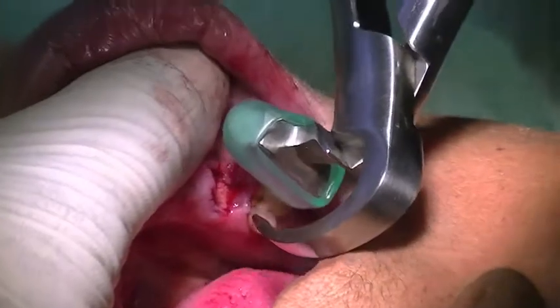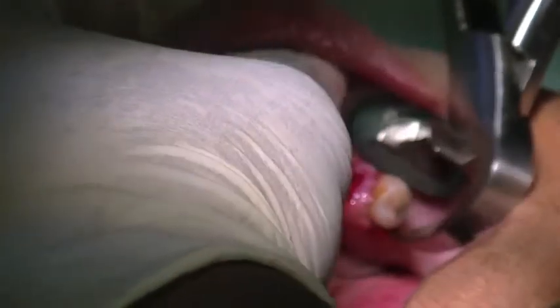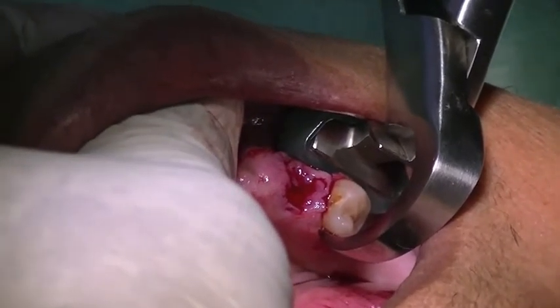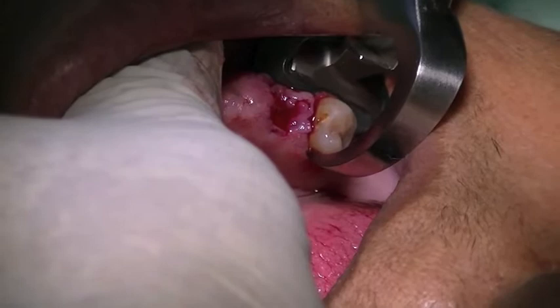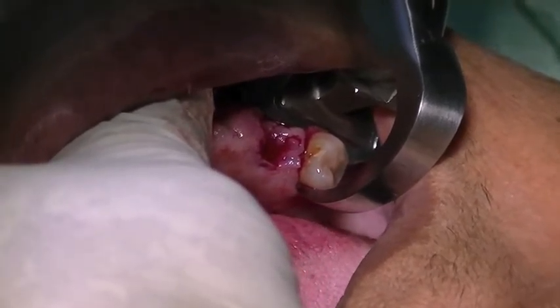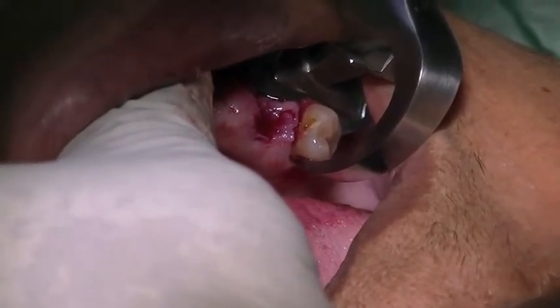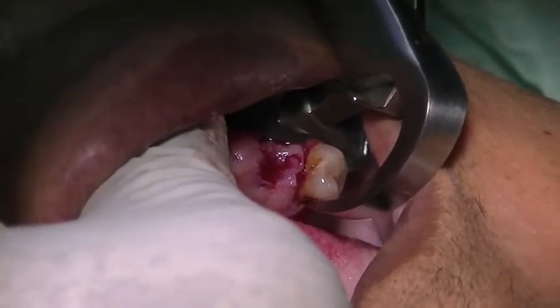Last one. Placing beak apically on the lingual and our bumper in the vestibule. Just going to rotate the wrist. Just waiting for the energy to build up to release the ligaments. And I feel it.